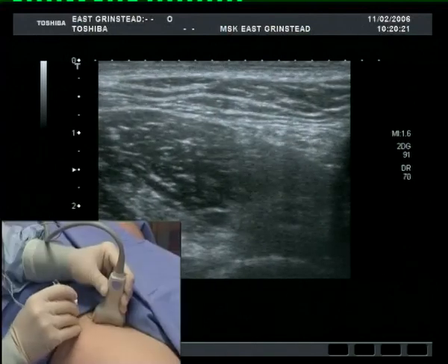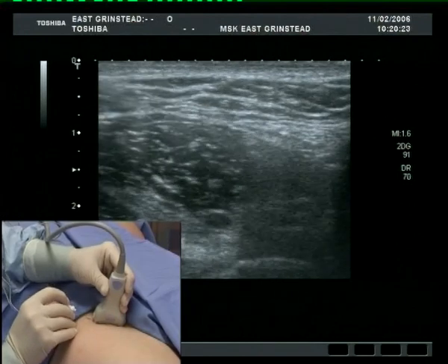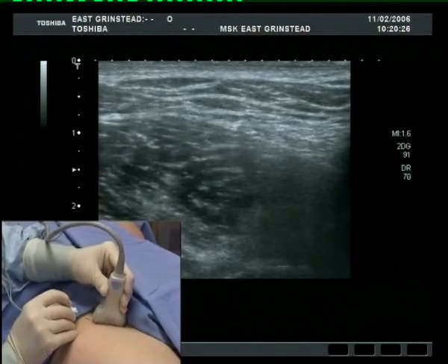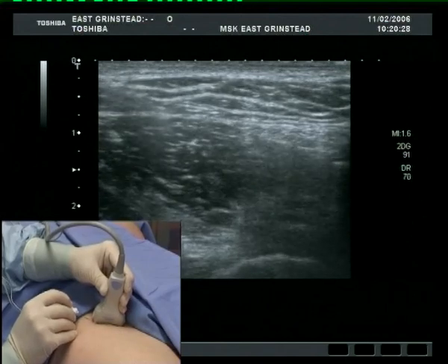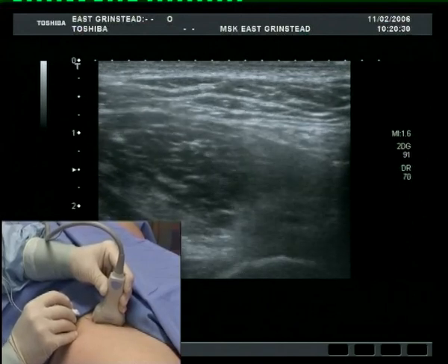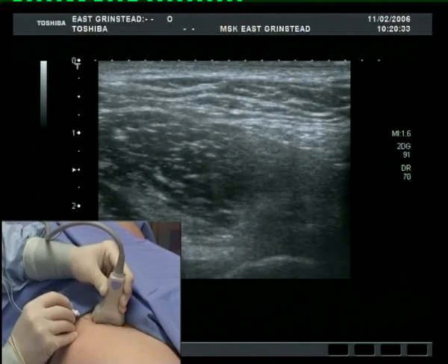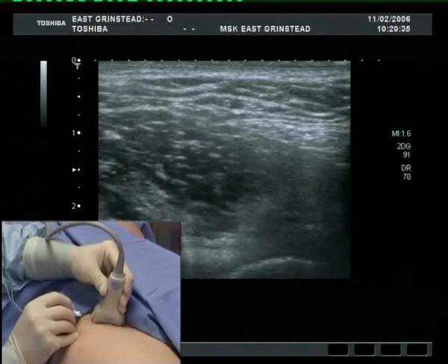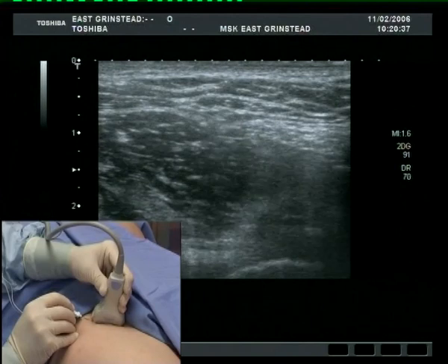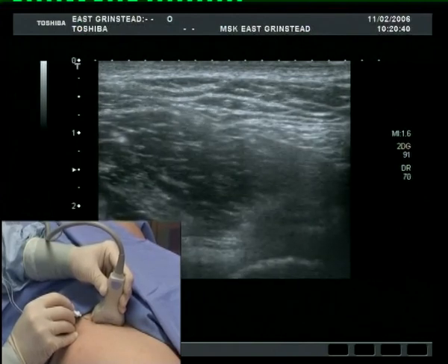The needle is applied to the femoral nerve. The needle is approached from the lateral aspect of the thigh, hence the needle appears from the left side in this ultrasound image. It needs to penetrate the fascia lata and fascia iliaca in order to allow spread of local anesthetic around the nerve. Small adjustments of probe and needle position improve needle visibility.